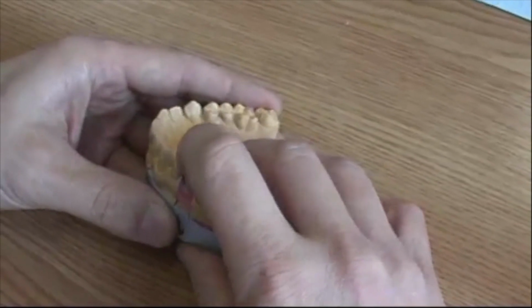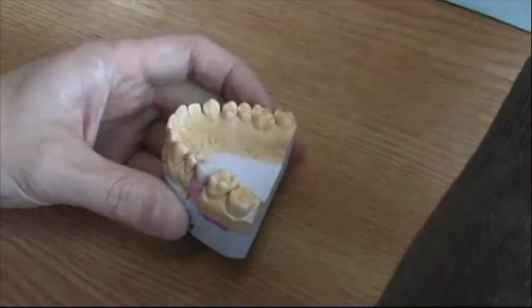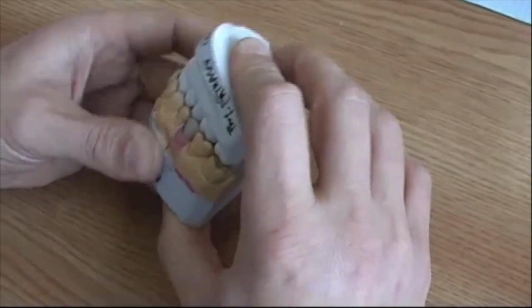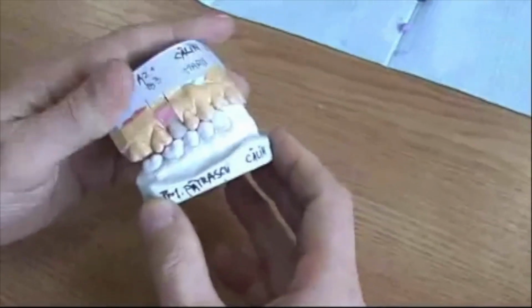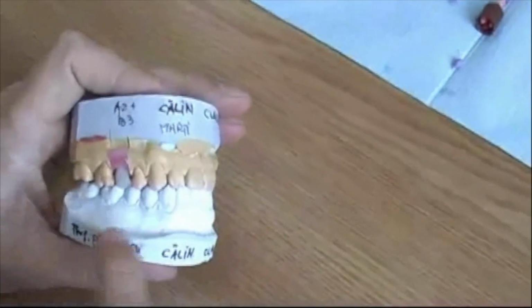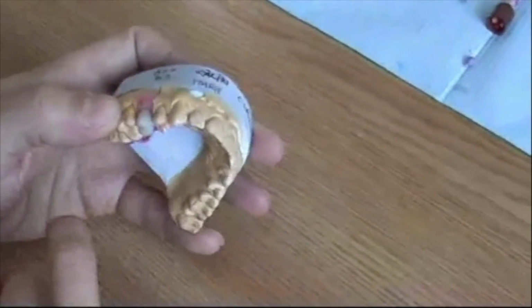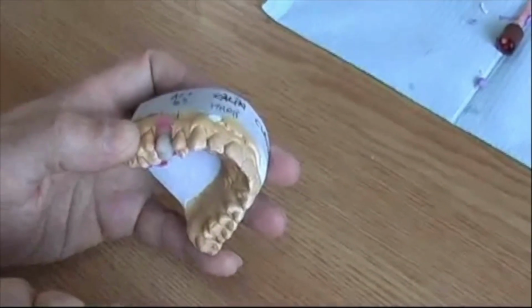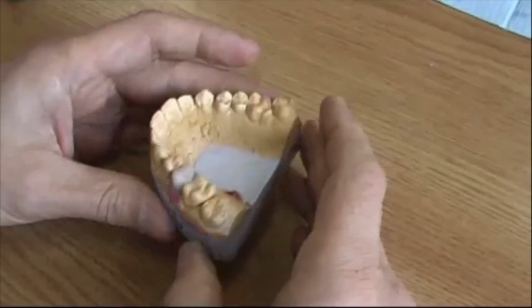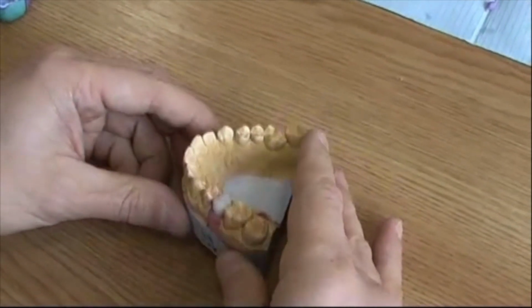And on the preparation now we can put the temporary crown that we made previously, and check whether everything is fine. Again, if the technician is doing the job quickly, then we can leave this temporary for, I don't know, 1 week, and then in 1 week the technician will give us the final restoration. So we have to see where it has high spots and trim it and polish it, and yeah, that's it. Done in the office.